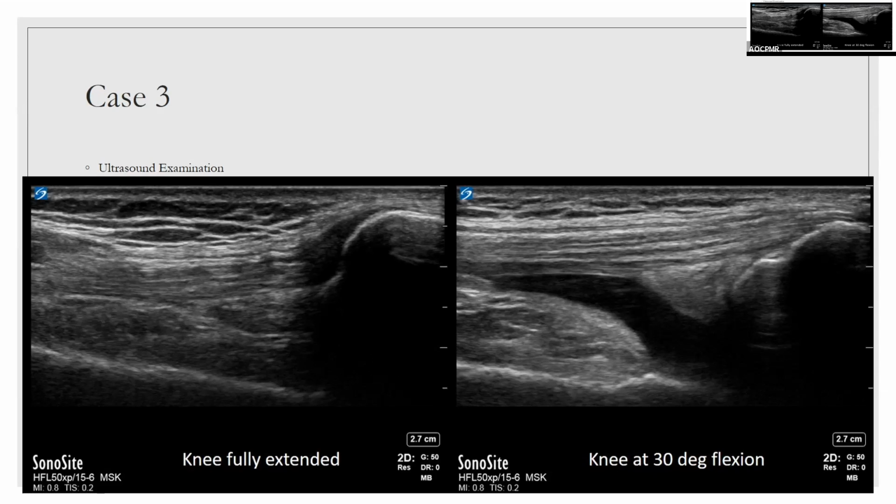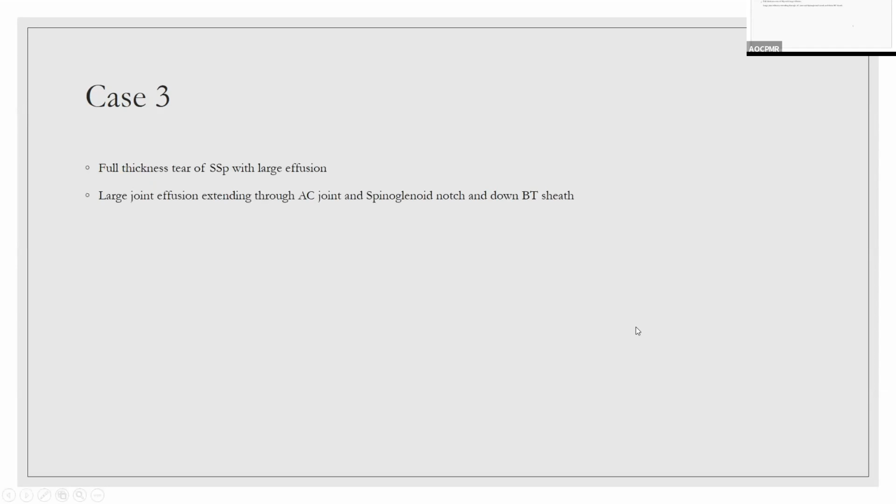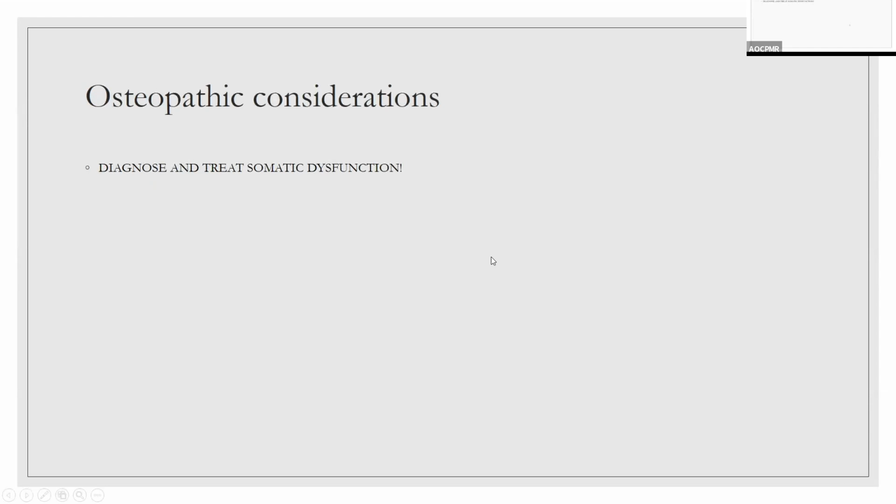Now let's take another question. Where did this joint effusion come from? Well, when you see joint effusions in the absence of any rheumatologic disease and really low suspicion of any infectious disease, 9 times out of 10, it's an exacerbation of osteoarthritis. Like one of my attendings used to say, the differential on this one is number 1, osteoarthritis, number 2, osteoarthritis, number 3, osteoarthritis. So don't forget about the zebras, but common things are common. This is just an exacerbation of OA. Ignore that. That was misplaced.